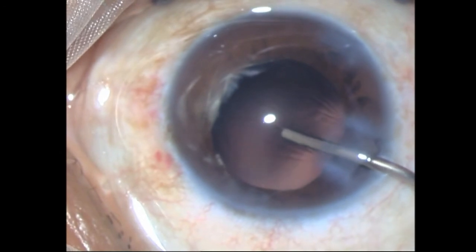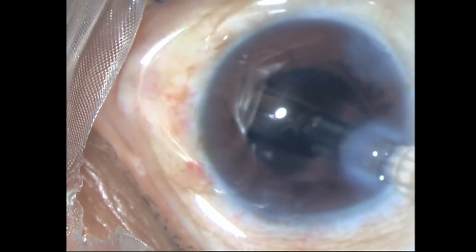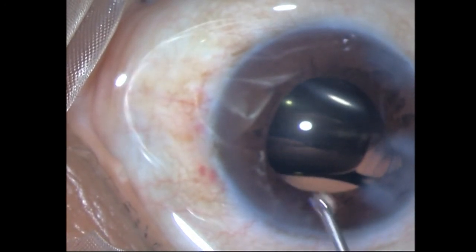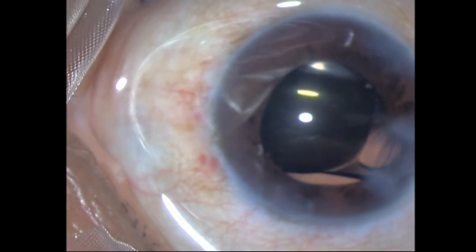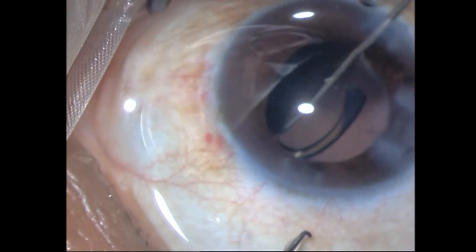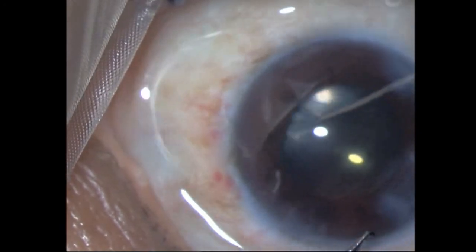Once that's done, this is a Hoya single-piece foldable IOL which goes in very easily through the 2.2mm incision. I tried to get it directly into the bag but didn't manage, so I put in some OVD over the lens and then with the dialer I just tuck it into the bag. I tap it into place and it looks very well centered — so there's nothing more to do. No CTS, no capsule tension segment — I'm just going to leave it like this.